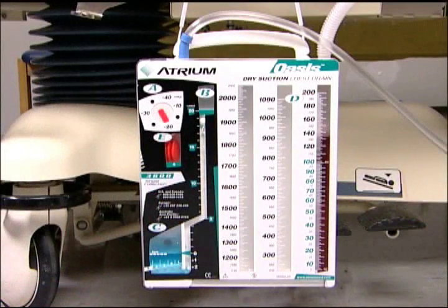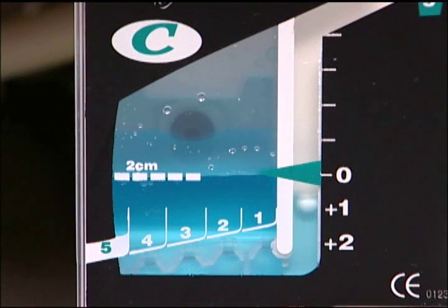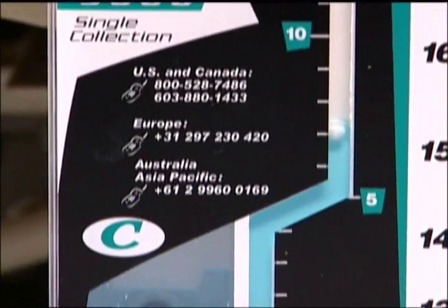A water seal is a simple one-way valve which allows air to exit the chest and prevents air from returning to the patient under normal conditions. It's also a very useful diagnostic tool as it can show even the smallest trends of an air leak as well as changes in intrathoracic pressure.